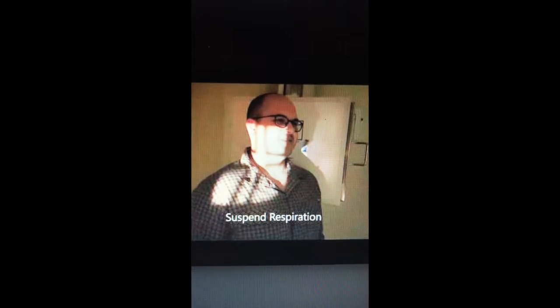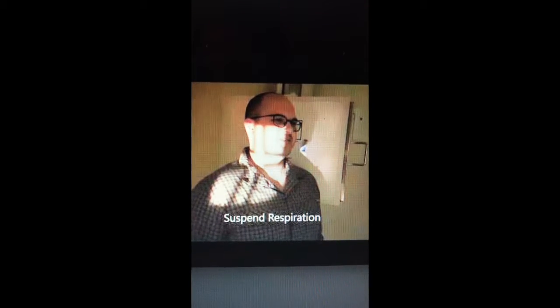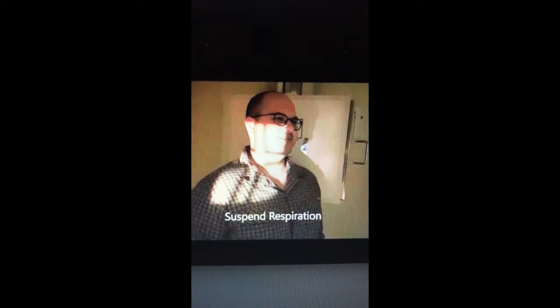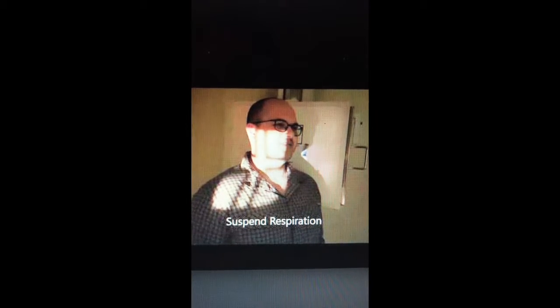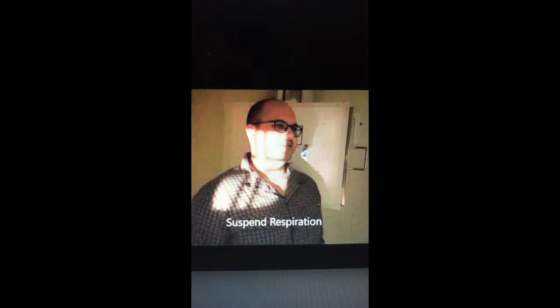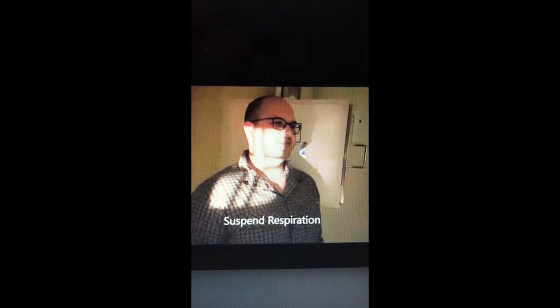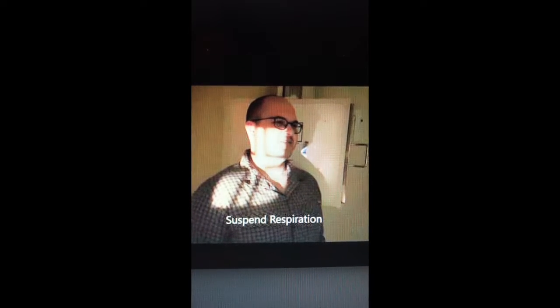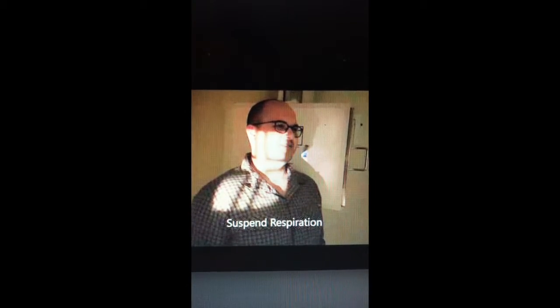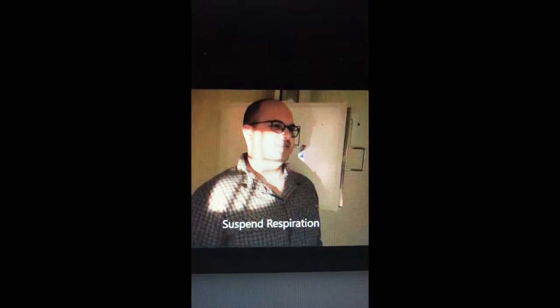If the patient can be done in the erect position, the mid-sagittal plane has to be aligned to the IR in order to have a good oblique position. The head and the body need to be rotated to a 45-degree oblique position. And the CR angle is 15 degrees caudal, centered to C4 in order to get the oblique position.